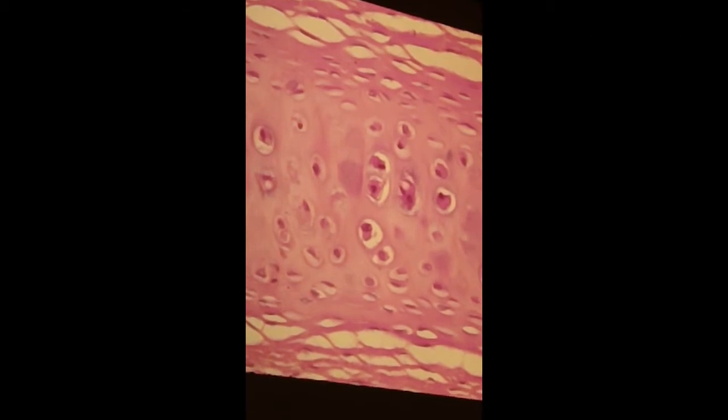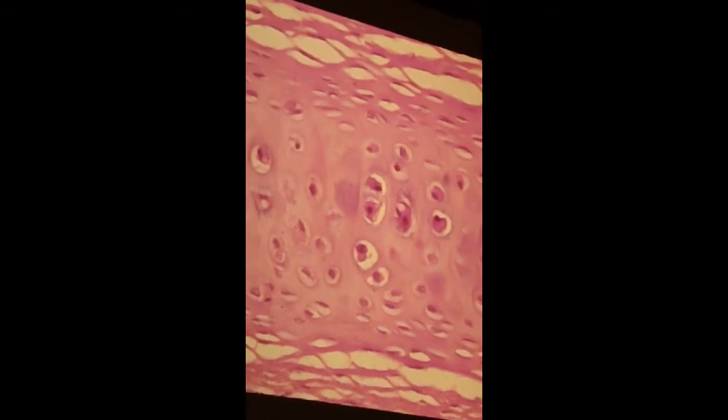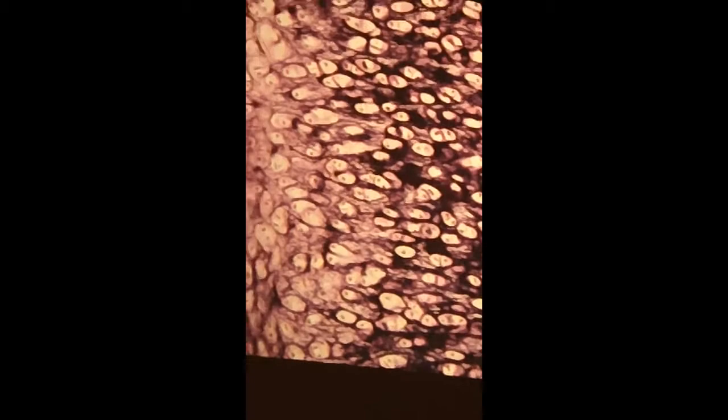So, you can't tell me, looking at this, and only with an H&E stain, whether this is hyaline or elastin, right? In this out-of-context shot. If it were in a context, you might be able to see some clues and tell me which is which. With an elastic stain, though, you can pick up the elastin. And the fibers in here are so dense that it looks completely solid, but you get out in that region there, you can see the individual fibers, okay?